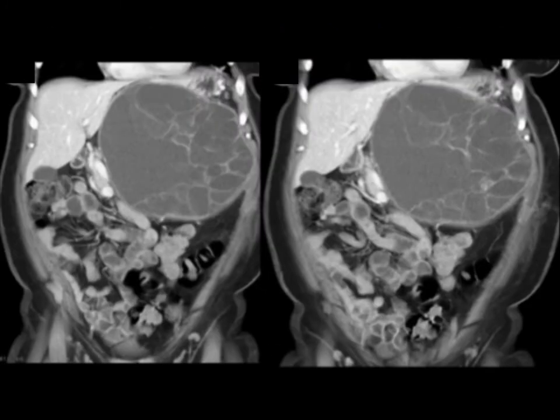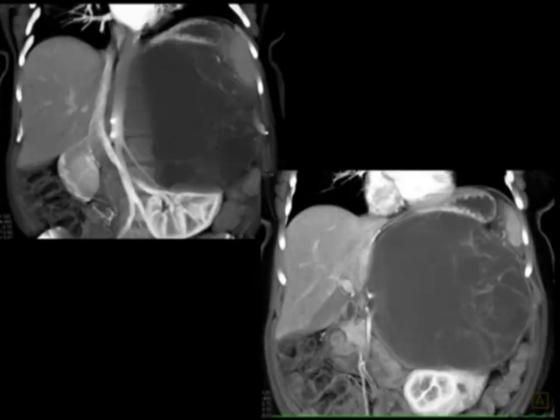Another case felt to be a large adrenal mass turned out to be a mucinous cystic neoplasm of the pancreas with invasive carcinoma — you can see the multiple septations. You might have considered a cystic pheo or cystic primary adrenal carcinoma, or perhaps a large complicated cyst. With large lesions it can be difficult, but those lesions are going to be removed anyway, so it's not going to be much of a problem.